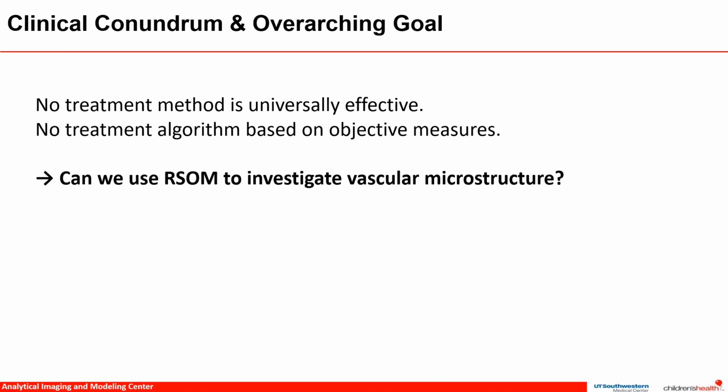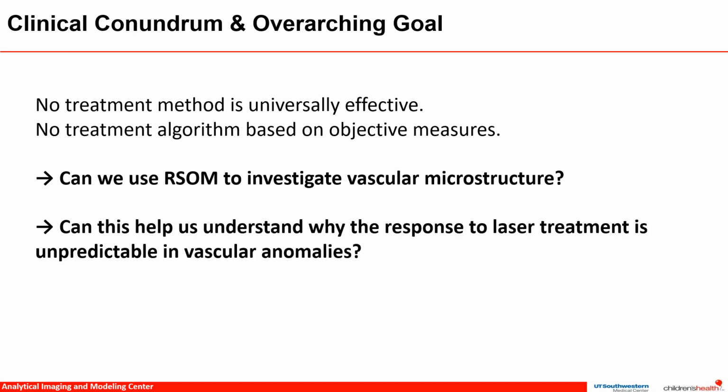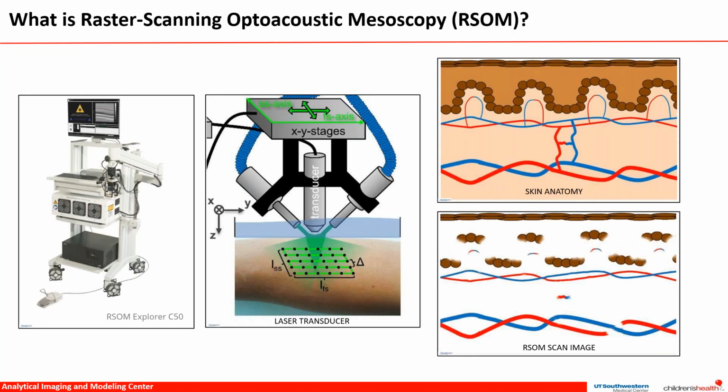Our question was, can RSOM help us do this by giving us a method of studying the vascular microstructure? Can our findings with RSOM help us understand why the response to treatment, especially with therapeutic laser, is so varied among patients? So now, what is RSOM?